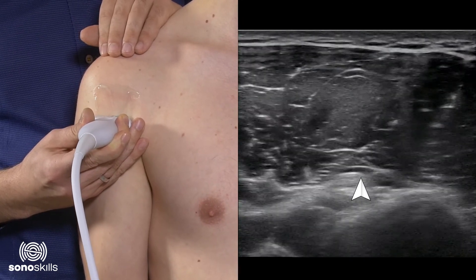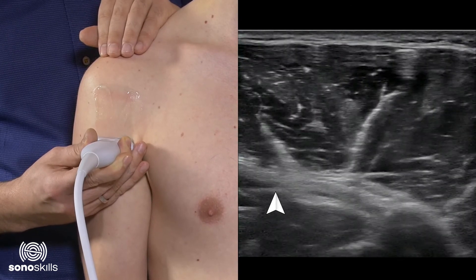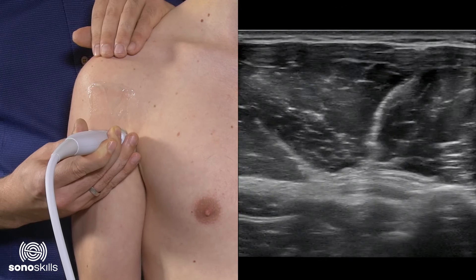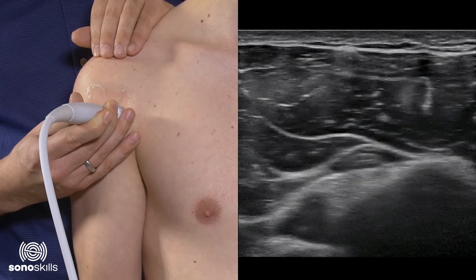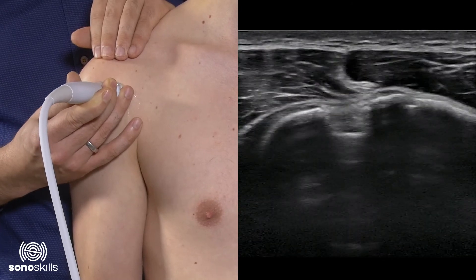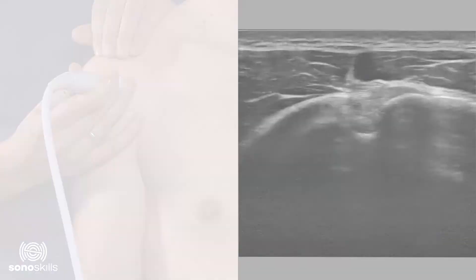Following the humeral shaft down, suddenly on the left side appears a long horizontal tendon now visualized on screen — this is the pectoralis major tendon, which is stabilizing the biceps to the humeral shaft. Following back up towards the inter-tubercular groove, with the humeral shaft in the middle of the screen, we can see the biceps going towards the shaft and there we have our bony landmarks again. Always be sure that the tendon is hyperechoic, because otherwise you could mistake it for pathology.